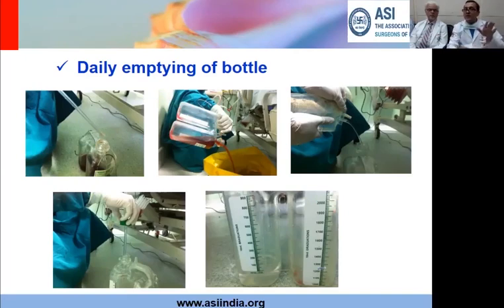Now please, this is a sterile system, and this system needs to be emptied in a sterile way. So when you open the bottle, when you are emptying the bottle, when you are putting the inside part back into the bottle, or when you are putting saline into the bottle, at all these steps, friends, sterility has to be maintained. So now in my unit, it's a clear-cut instruction that these are only done by nurses under supervision of one of the residents. They don't do it ever alone. If they have to empty, they will call one of the doctors and they do in front.